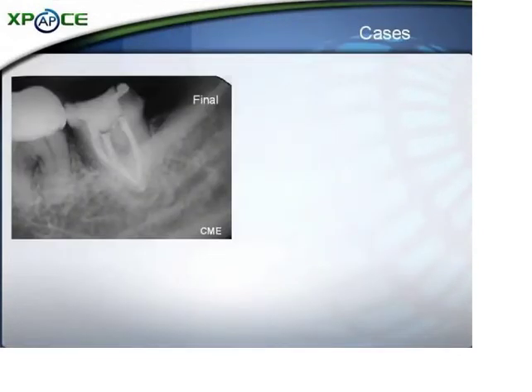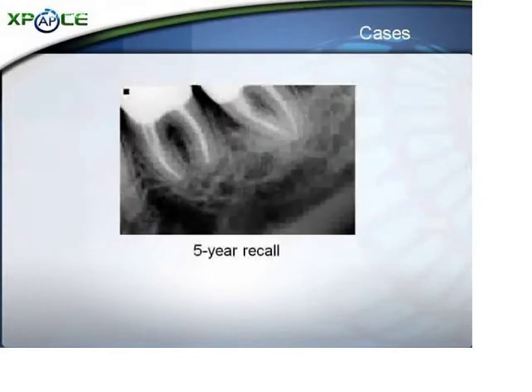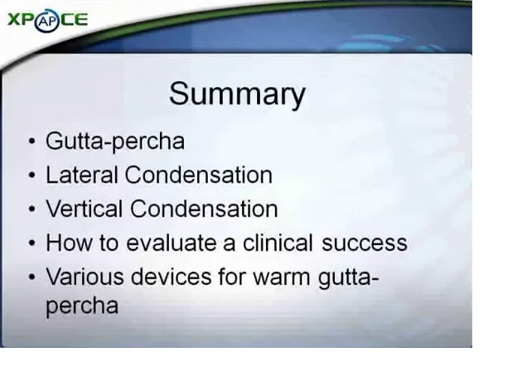This ray demonstrates the final fill of the second molar. Note the obturation of both molars. This is a successful 5-year recall on both molars. This concludes the lecture on obturation of the root canal system.